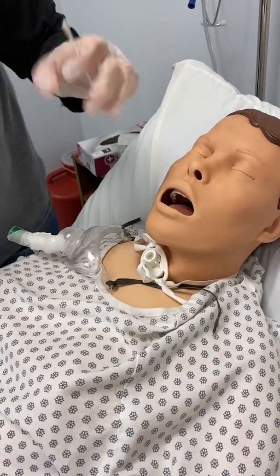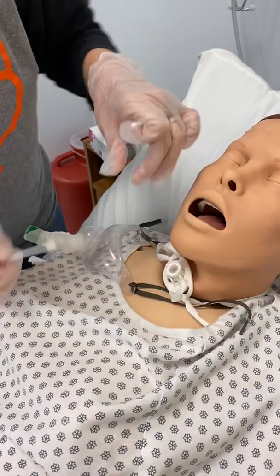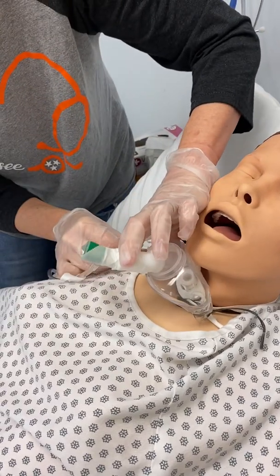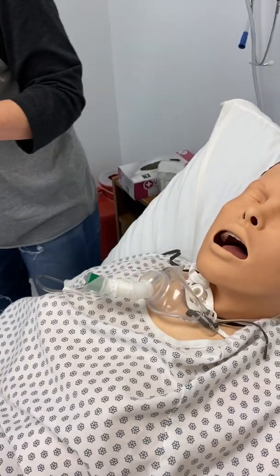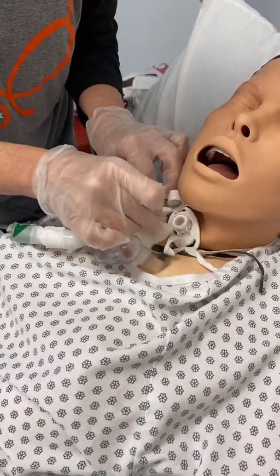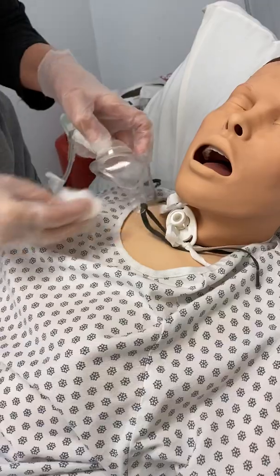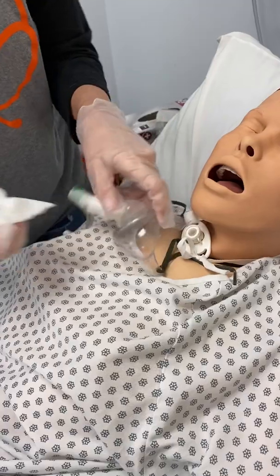Again, you got to get right up close to the insertion site. 2 swabs. And we'll do a 3rd swab. These do not lay in these mannequins' necks as well as they should. I'm going to take my gauze if I need to and clean around my faceplate. Take my last one and clean it up in here, or you could even clean around the patient's neck if it's got a lot of secretions around it.